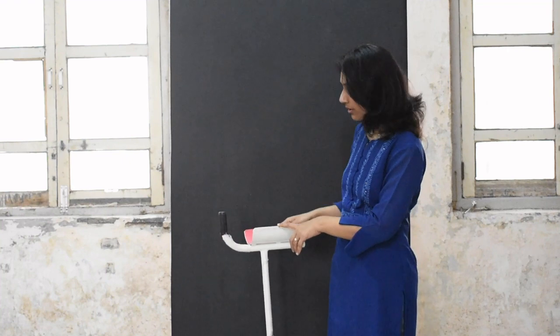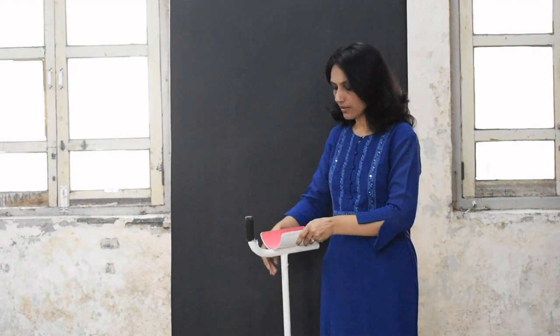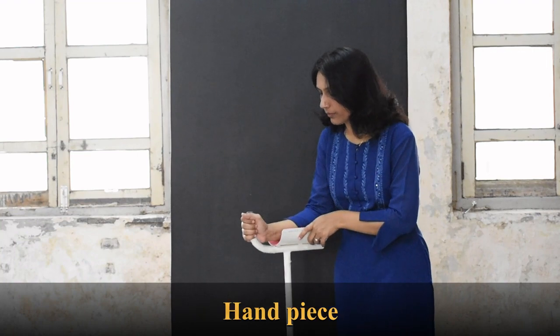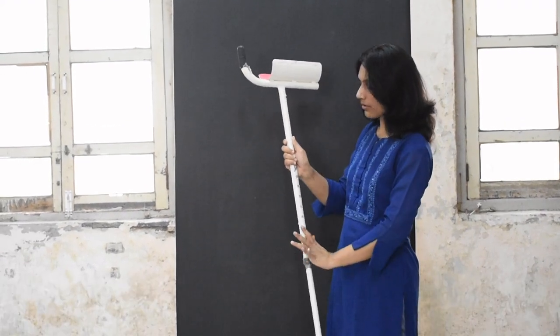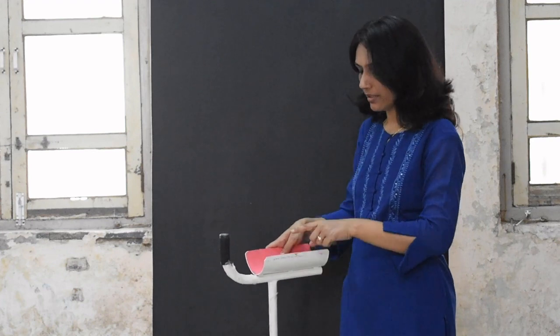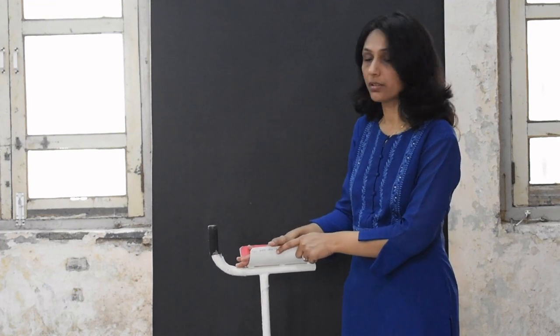Coming to the parts of the gutter crutch: you have a padded forearm piece — it is padded inside. Then you have the hand piece which can be adjusted. Below you have a single upright and at the bottom a rubber tip. The upright is adjustable, and while the angle of the hand piece is not adjustable in this model, some other crutches do offer that adjustability. The upper forearm piece is padded and the frame is made up of metal. These are the parts of the gutter crutch, basically used for rheumatoid arthritis patients.